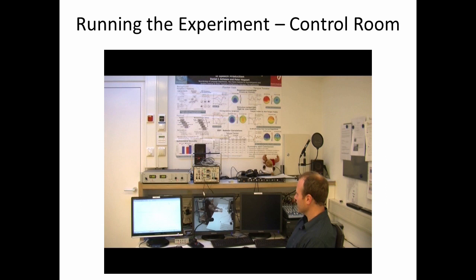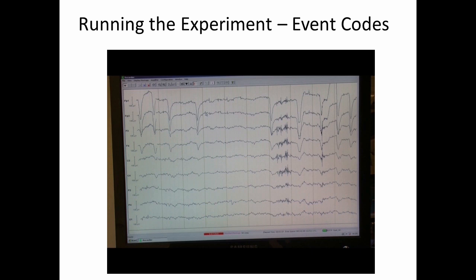In this video, you'll see an experiment in progress. As the experimenter, I'm sitting on the right and looking at three monitors. On the right is the display screen showing what the participant is seeing. In this particular task — the flanker task — they're responding with a left and right button press according to the direction of the middle arrows. You'll also notice those two little dashes, which are indicators to the subject that they can blink at that point in time. I'm also watching the screen on the left, which is the raw EEG signal being recorded, where I'm looking for things like artifacts due to eye blinks or electrode channels going messy. In the middle, I have a video of the participant themselves as they're doing the task.